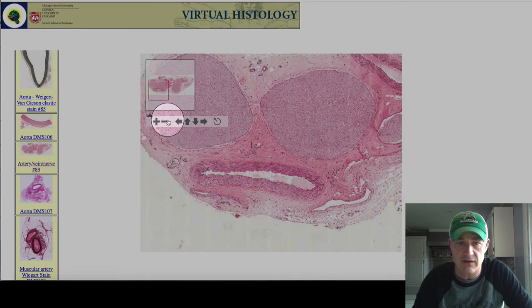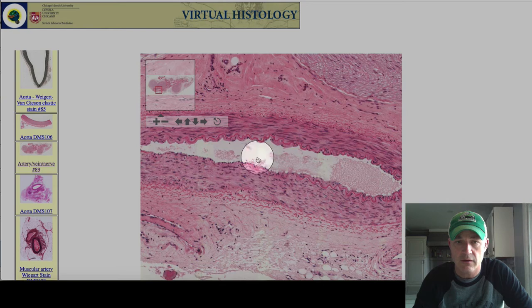You can see if I zoom in on it a little bit more, that gets that little squiggly line that I was talking about, what I always call a hair scrunchie. It's because there is a lot more elastic tissue in the walls of these ones. The other thing you can see is this layer of smooth muscle surrounding that inner part of the artery. So the tunica interna, this would be the tunica media, and then you're getting out to the tunica externa right here. You can see the little blood cells in the center. So that shows you the thickness of an artery.